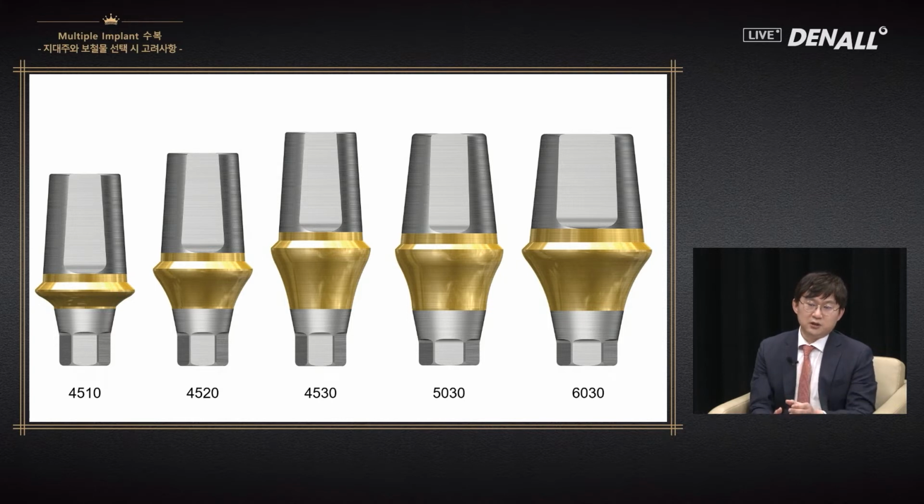If the distance between the cement gap and the implant connection is very short, that is not very good, and the profile would be thick.